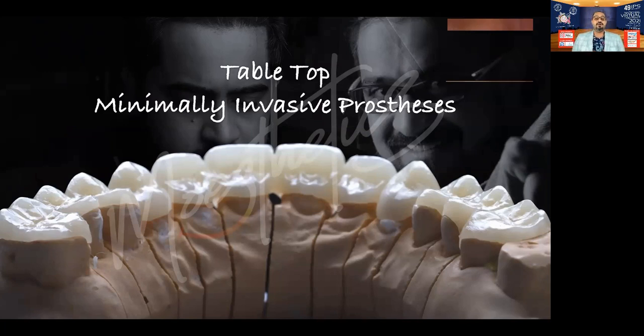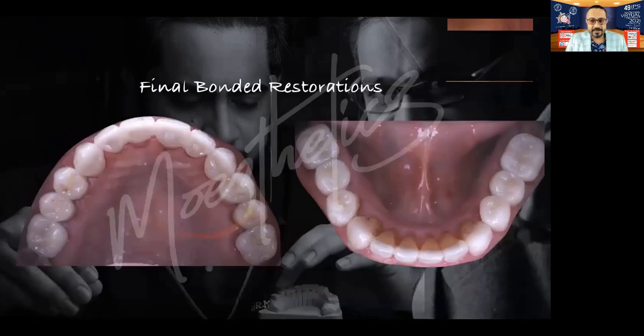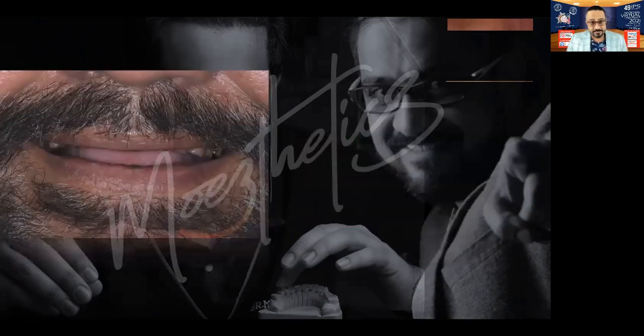Very important again: use rubber dam and bond all of these individually. This is how the patient looks immediately post bonding — occlusal view maxillary and mandibular. Here we had to use a medium opaque ingot of the e.max. Because this patient had a lot of internal staining and discoloration, had I used a translucent one it would have looked more aesthetic, but the underlying yellow dentin color would have shown through. So we used a medium opaque, or MO ingot, to mask that.